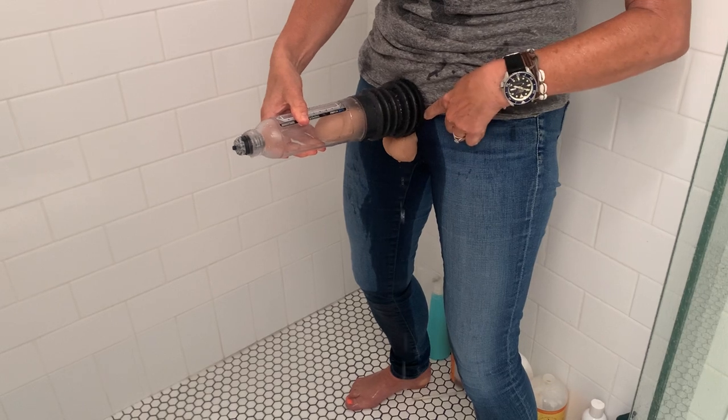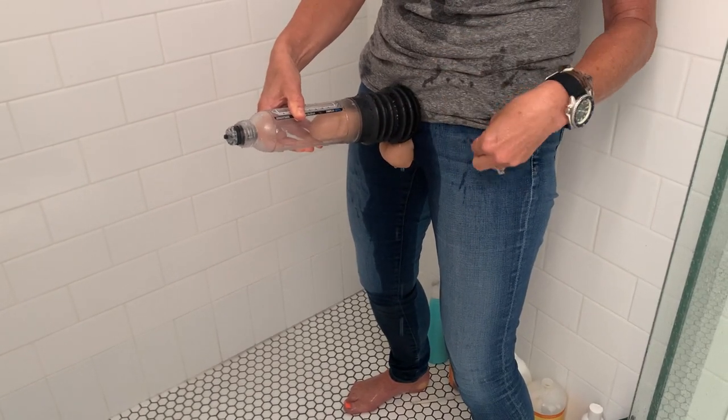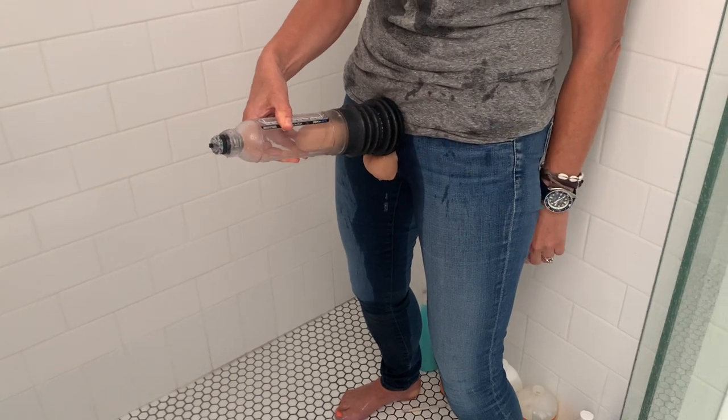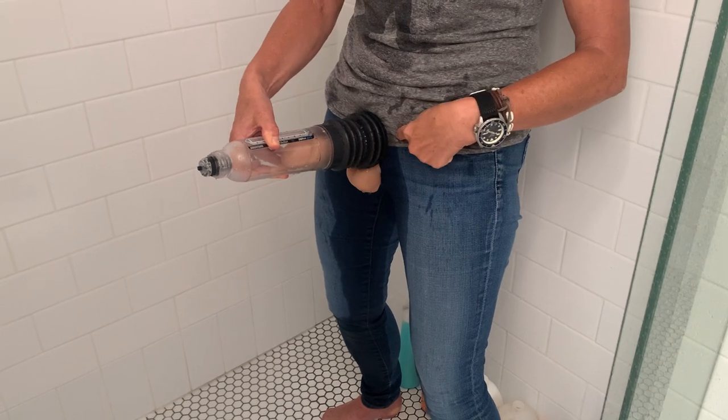Now you need to have a good seal on your pubic bone. So if you've got lots of long fuzzy pubes you've got to trim them nice and short, because if you've ever been snorkeling and you get a bit of hair stuck in your goggles they leak — same with this.